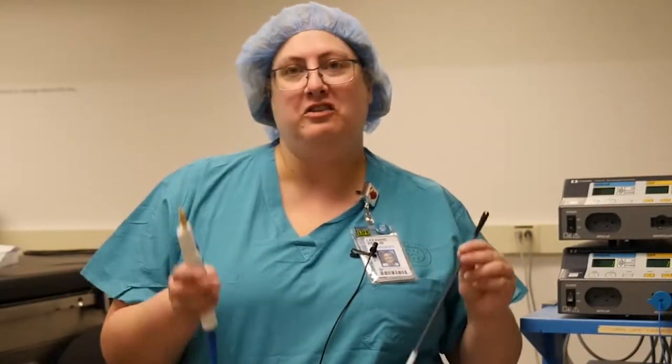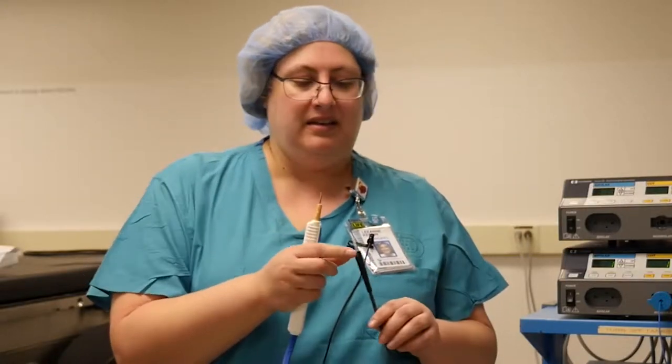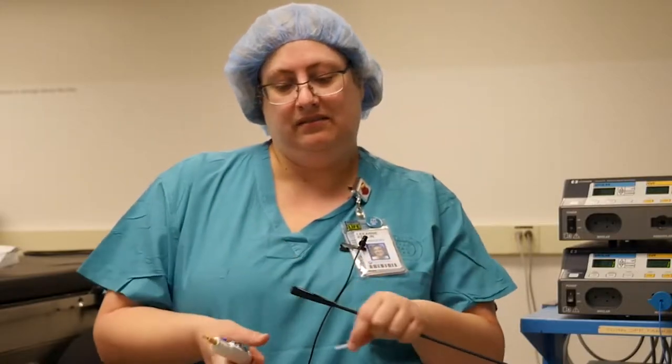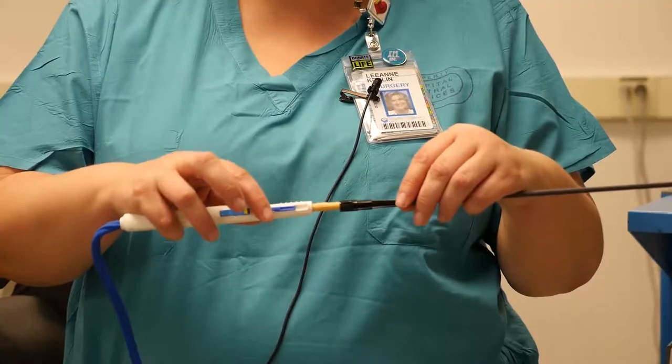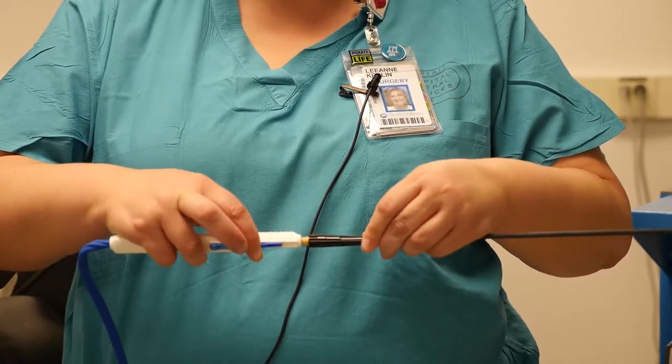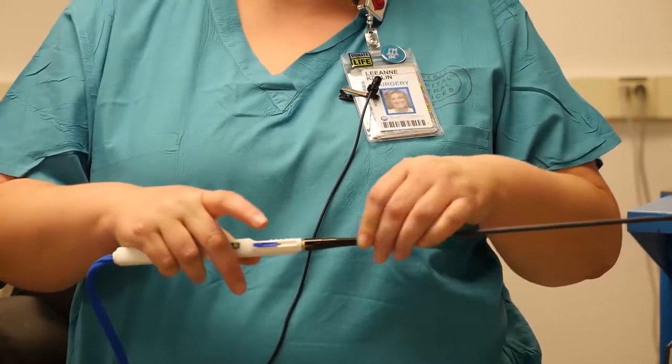When using the laparoscopic argon, after you pass everything out to your nurse and she's plugged it in, then you take the tip and you move it up. Take this part off — the little plastic thing. And then you slide it on through the grooves that it has and you just slide it right in. And that's it.